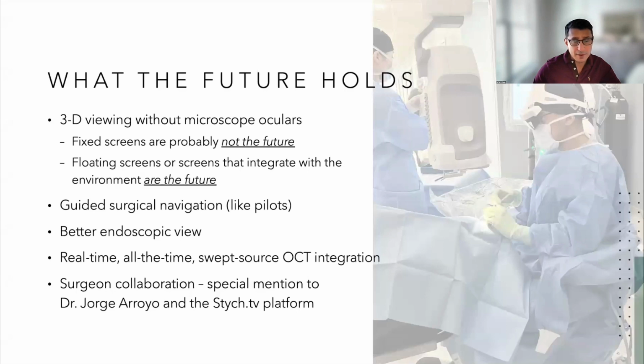Guided surgical navigation, like pilots have, they put their augmented reality in the cockpit so they can overlay lots of instrumentation. We need to be able to do the same thing. We need better endoscopic view. So endoscopic vitrectomy, we haven't really talked about that, but it's not really taken off because the view is not so great. So we need better resolution and better ease of use of endoscopy.